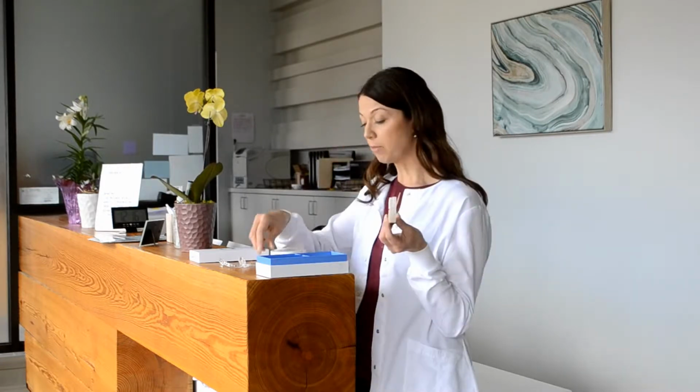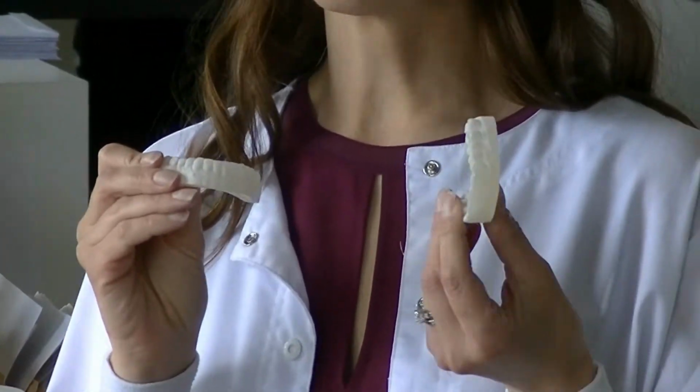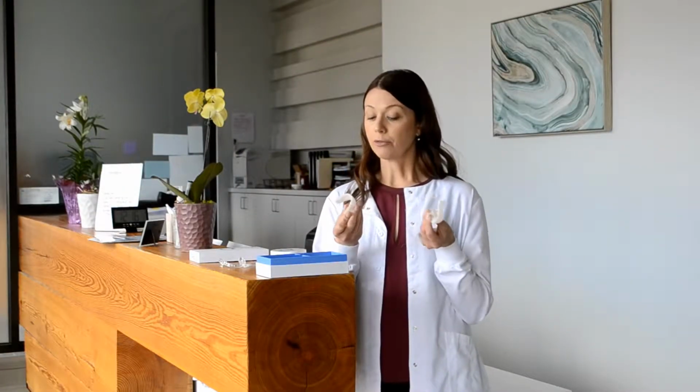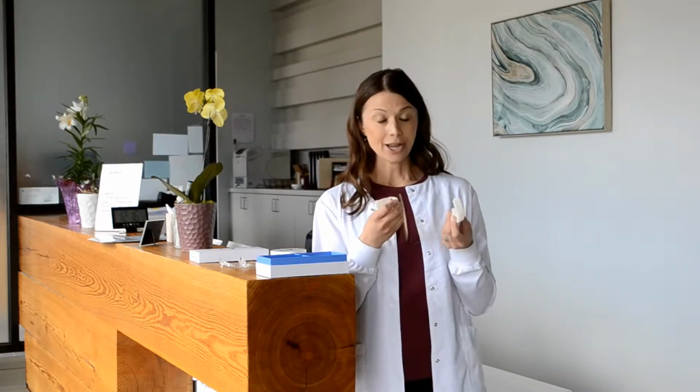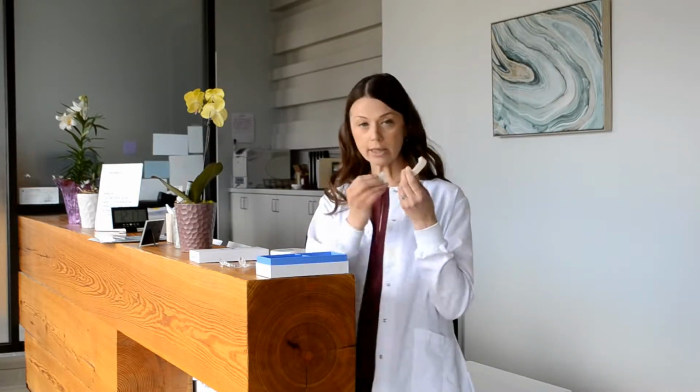The lab then fabricates this 3D model. So they scan it with digital scanning and then create a model that looks like this. The thing I love about that is that if by some chance something happens to your device, it doesn't take much to remake a top or a bottom appliance. So for instance, we had a patient and his dog accidentally got to the top. Unfortunate circumstance, a little bit pricey circumstance, but with just a phone call, I was able to remake his upper appliance and it was totally fine for him and really quick turnover. So we get these models.